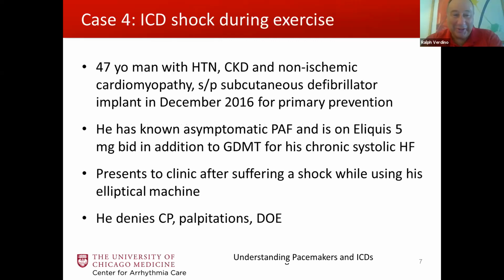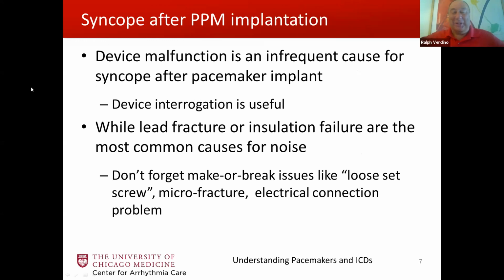All right, let me ask you a question. Did you leave the lead? I did. I did not extract the lead. We're an extraction center, and we were ready to do whatever. Once we saw on the X-ray that this was most likely a pin issue, and remember, the saturation of that amplifier and that noise was very suggestive of electrical EMI, that type of interference, or make or break, we decided to leave the lead. We did this case in 2016. I just saw him in clinic literally 3 months ago, and he's doing fine.